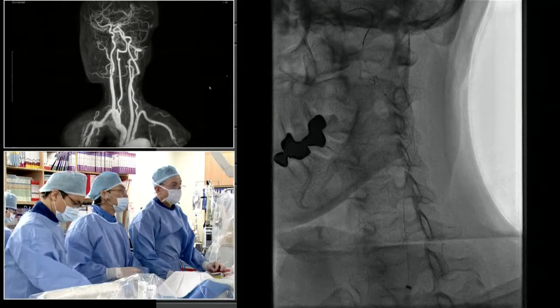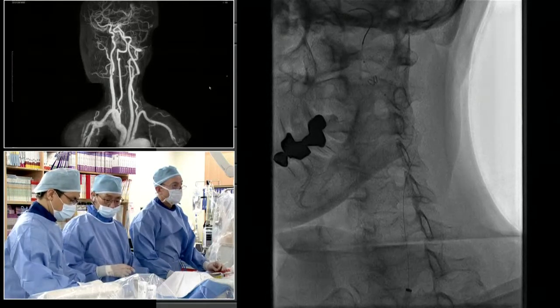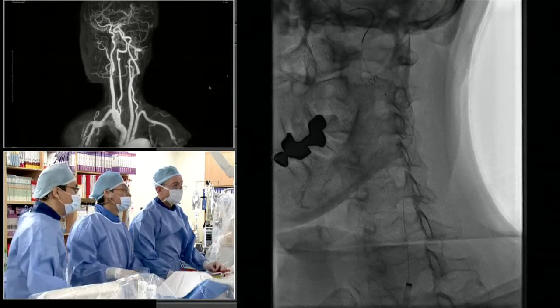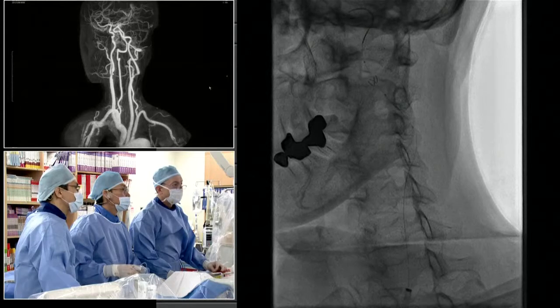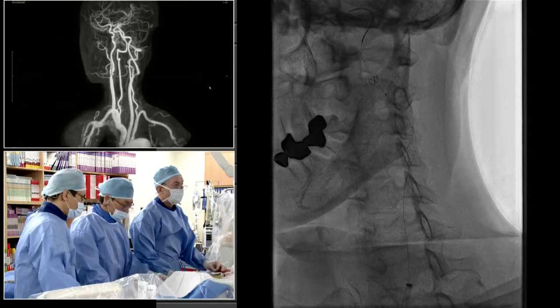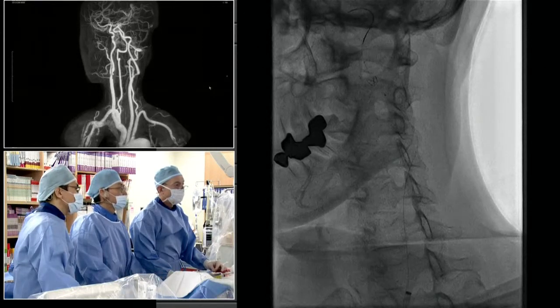Mark, as you do that and get the balloon up there, great case. In the U.S., we're limited in terms of what filters or stents we use, or whether, in fact, we do carotid stenting at all, based on trials and CMS and reimbursement. But a question for you and for the panel: all else being equal, is there any particular distal filter you would prefer over another, or do you base it just on what's available at the time?